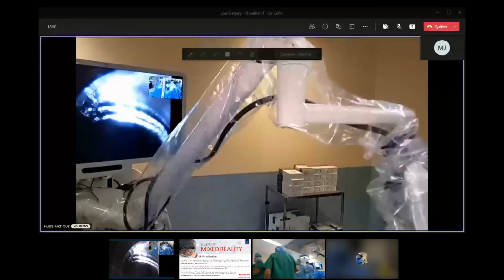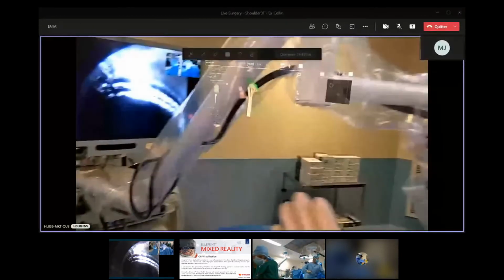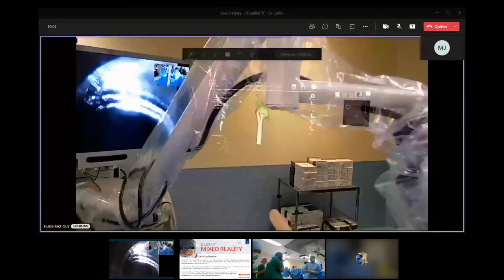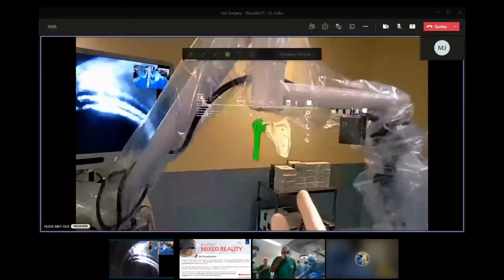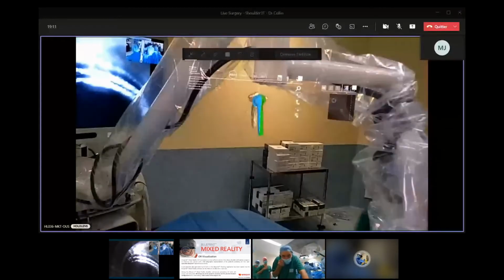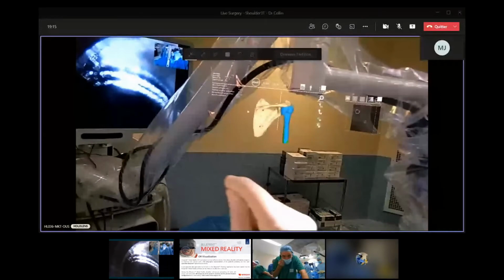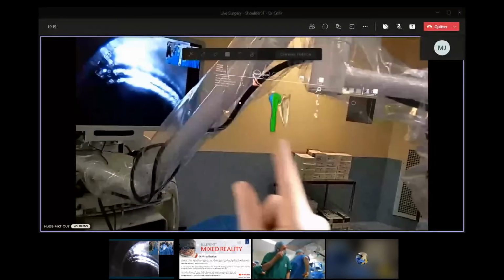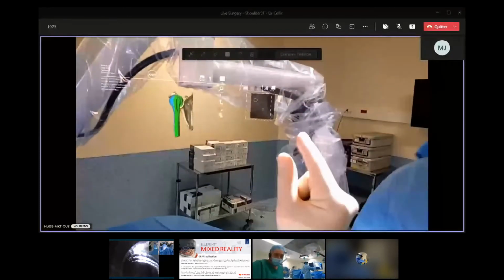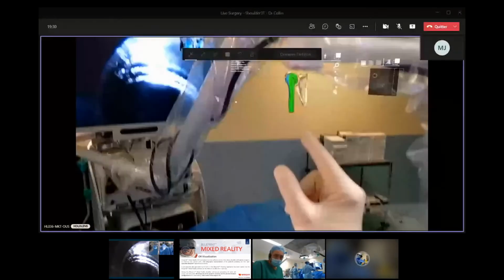It means that I will operate here, like that, and each time that I want to assess and to check something, I have everything here. Here, I can see the anatomy, as you can see, and I can take it, I can do this, I can look at the posterior subluxation, I can look at the arthritis. You see, it's very easy to do everything like that. Then you can have here all the CT scan. If you have any problem, you can check on your CT scan on all the slices. And here I have my planification.